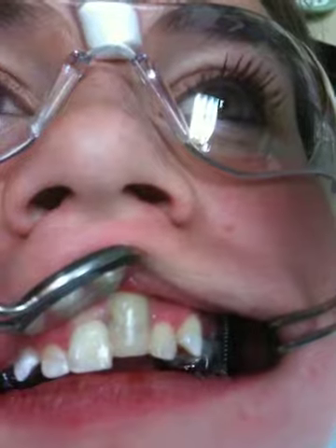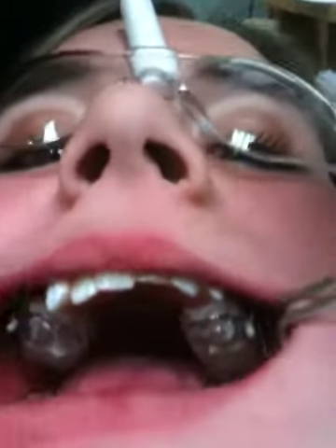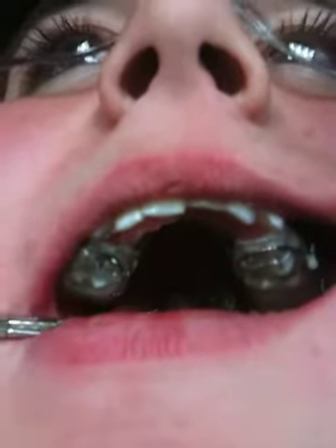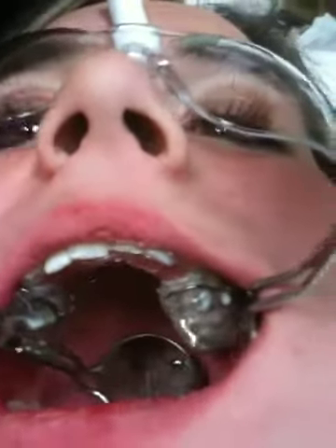I'm going to turn it up properly. I'm just going to open really big. Like that. I'll just use your mirror to reflect a little light up above. Chin up high. Chin up really high. Open really big. On the other side.